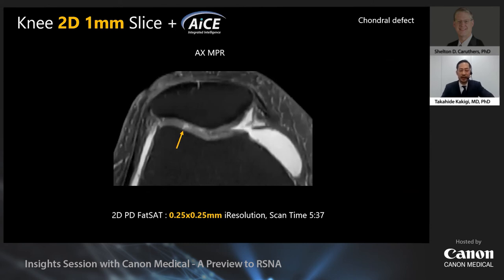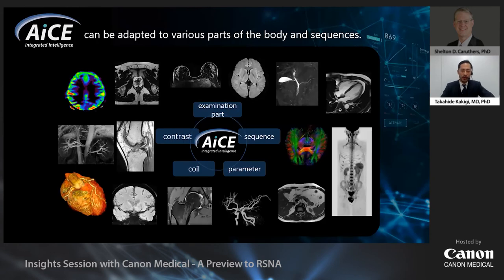This is another knee case. The cartilage injury is clearly depicted on the transverse MPR image. In 3D it's almost impossible to detect whether there is an injury or not — I believe 2D images delineate cartilage injury more clearly than 3D images. Today I introduced the usefulness of 2D high-resolution images with ACE in musculoskeletal radiology. The main feature of ACE is that it selectively reduces noise and is independent of examination part, sequence, parameter, coil type, and contrast. Therefore it can be applied to various parts of the body and sequences.